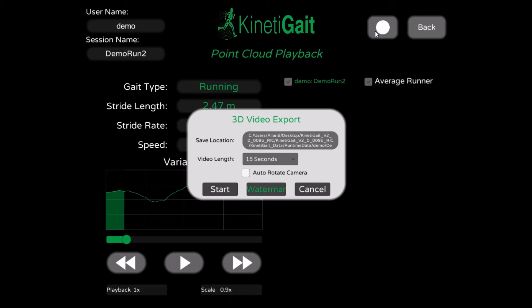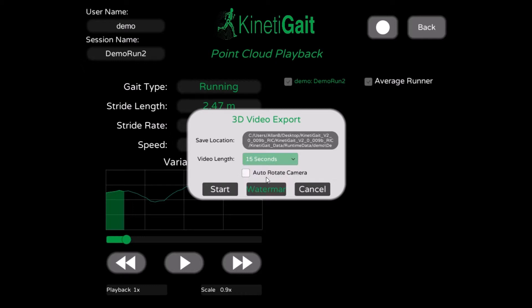You also have the option of adding a custom watermark, choosing the video length, and using the Auto-Rotate feature. The Auto-Rotate feature will create a video of the desired length which will rotate 180 degrees about the subject from an elevated perspective. With this option toggled off, you can manually rotate about the subject. Note, any changes to the Scale or Playback Speed settings will be persisted into the video, but cannot be modified during recording.